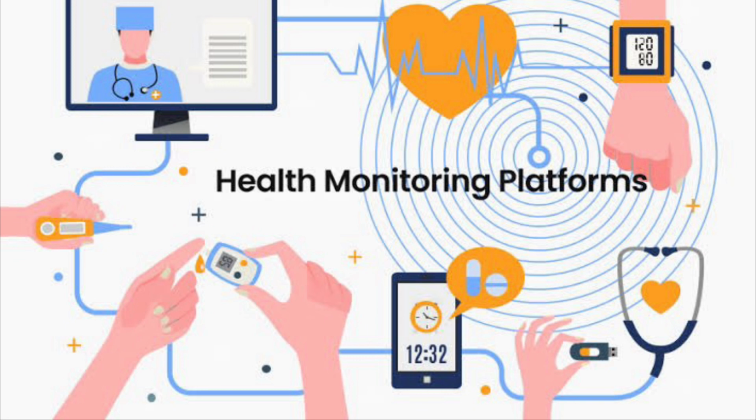And the clinicians also should be trained to monitor this. Here comes the problem. When you generate data from a patient for whom this is not indicated, a lot of unnecessary data is being generated. Second, any fault of the device can produce false alarms. So this is what is called false alarm fatigue or false alarm overload. So it becomes mandatory that somebody has to address these false alarms and take action based on that. So when you generate data for a subset of patients where it is not indicated, then it becomes a problem.